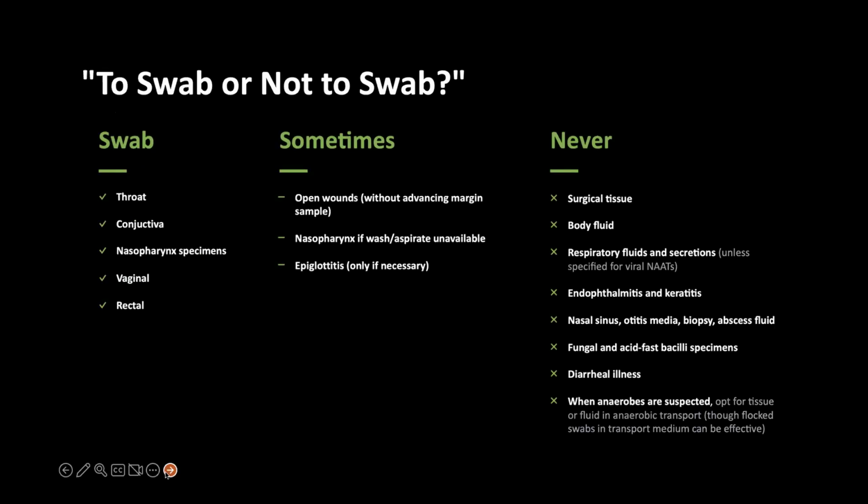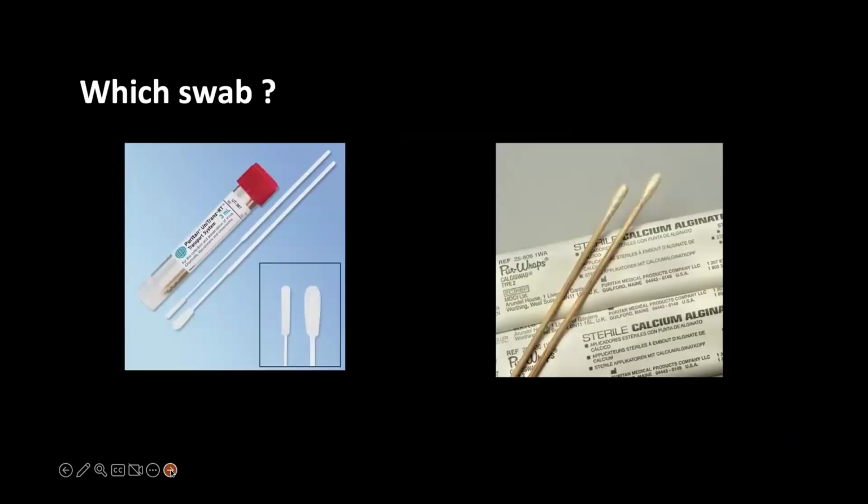So for some tests, a swab is acceptable, and mostly that's the throat, the conjunctiva, and the nasopharynx, and vaginal and rectal swabs. But mostly you should never send a swab where you can get fluid or pus or tissue. And next slide.